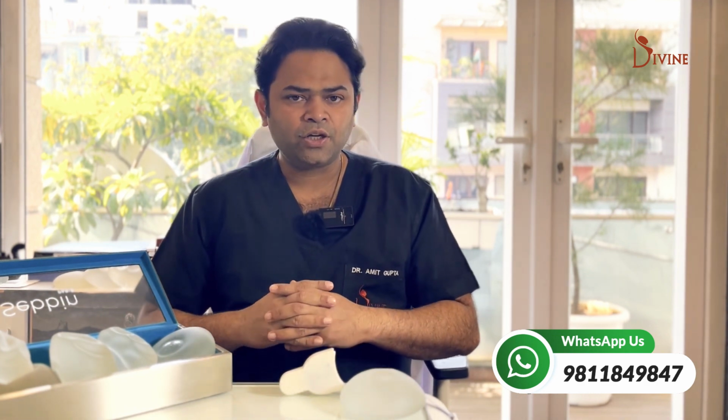Let's consider another scenario. Suppose the breast is very tight, the skin is very tight, a young girl, then we are not able to put a very high profile implant. So we have to explain that this is the maximum that you will get.